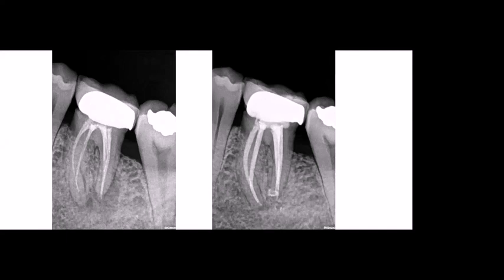So our main objective when we do a root canal treatment is to decrease the number of bacteria inside of the root canal. If we decrease the bacterial load, we will have a very high success rate. For example, in this case, the first dentist that did the root canal treatment didn't disinfect correctly. After doing the retreatment, we disinfect correctly, and then we can expect success in most of our cases.